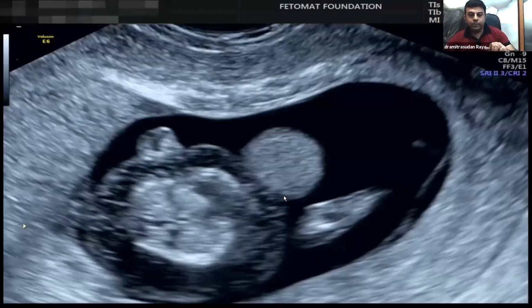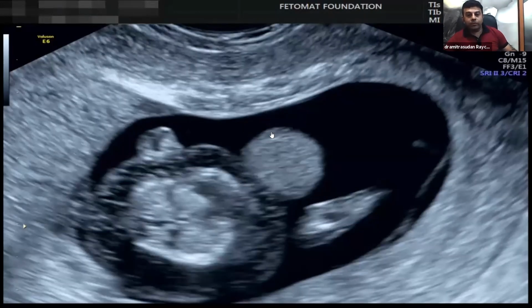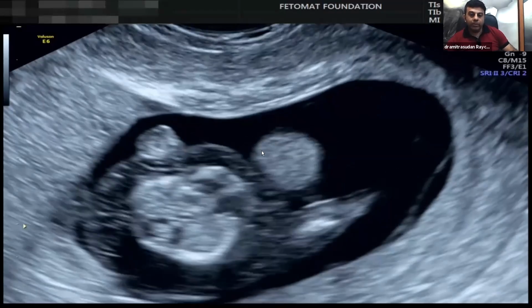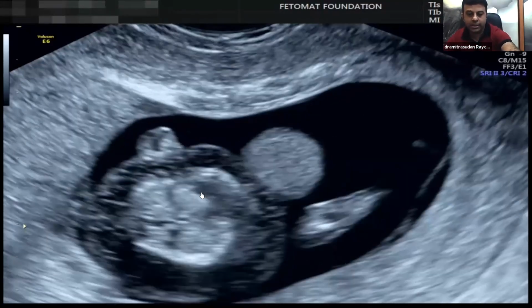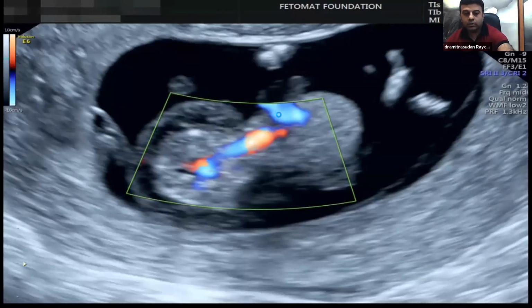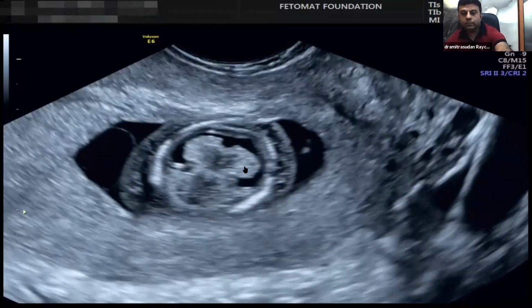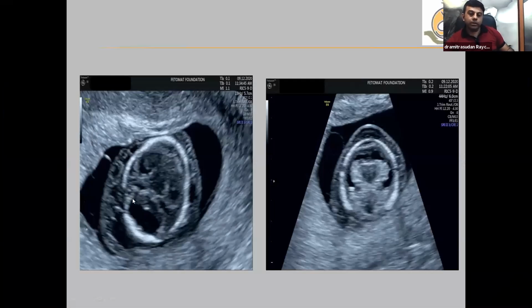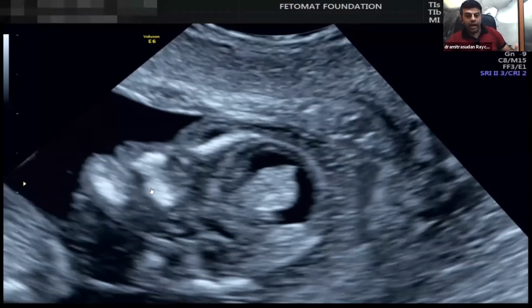The video clip shows the anterior abdominal wall defect with herniation of gut and a hypoechoic liver, and an echo-reflective membrane here, which means it is bounded by a covering membrane. The stomach and heart are on the same side, with the apex of the heart towards the left, ensuring normal situs. The cord is inserted directly into the defect. The fetal brain shows an intact calvarium with absence of the midline falx and a monoventricle. And there is also a cystic posterior fossa lesion. The profile view shows an intact palate on one side and a gap in the palate on the other side.